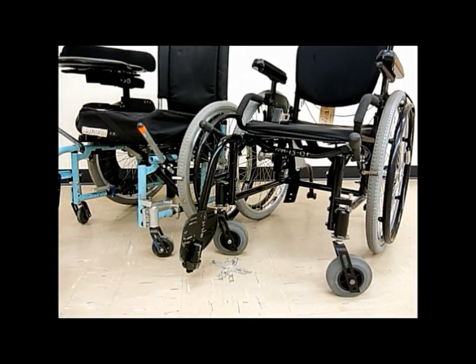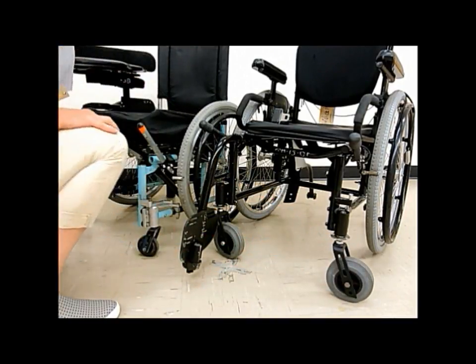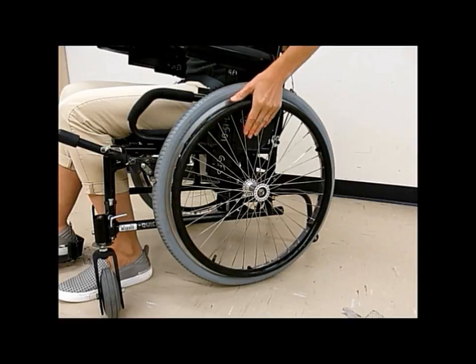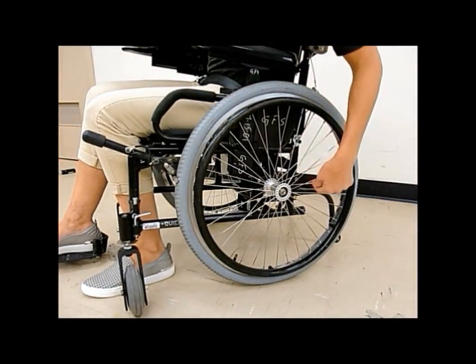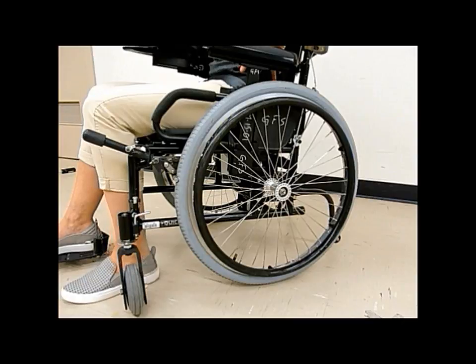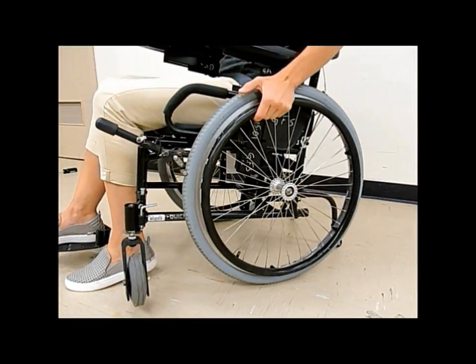However, a small caster doesn't interfere with foot propelling as much as the larger caster does. So when this foot is propelling, it may get caught. So there's always advantages and disadvantages of your wheelchair setup. For the wheel position, when foot propelling, you want the wheel to be as far forward as possible. So it's important to have an axle adjustable wheelchair. So in this area here. This will need to be assessed for each individual as the center of mass is different for different bodies. Wheels that are forward make propelling and maneuvering easier, but the chair more tippy, so the anti-tippers are required.